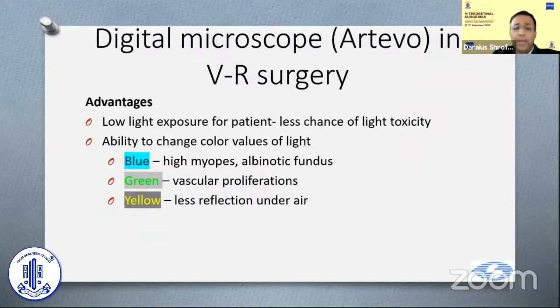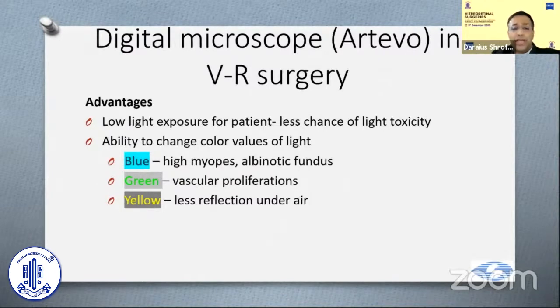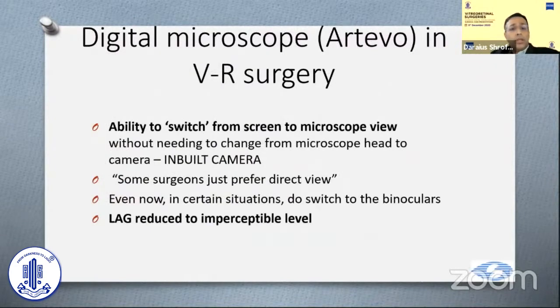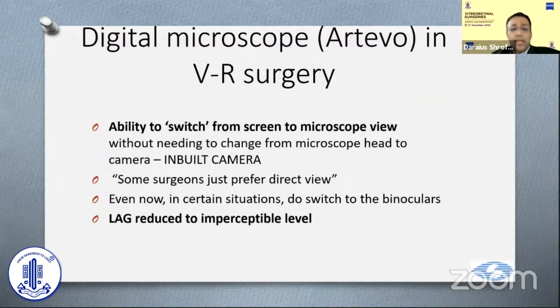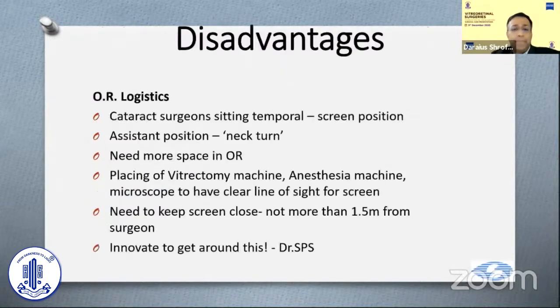For example, blue colors for high myopes or albinotic funduses, green for vascular proliferations, and yellow which has less reflections under air. A great advantage of this system is the ability to switch from the screen to the microscope view without needing many maneuvers, so you can switch as per the surgeon's preference. The lag, which was always a problem earlier, is now almost imperceptible with this system.